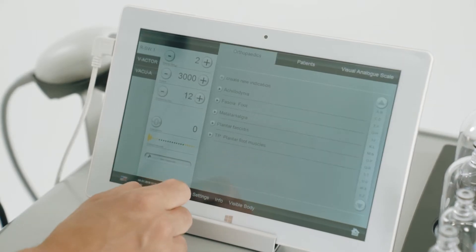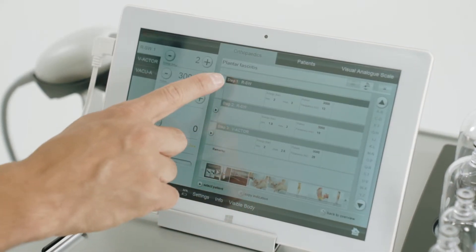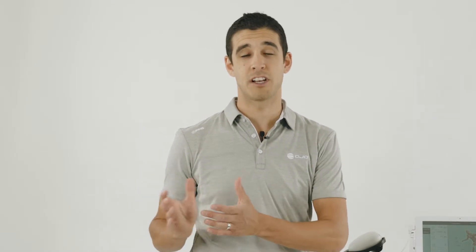The MP200 tablet comes inbuilt with all the clinical protocols. Simply select the body part you wish to treat and follow the prompts. You will notice that step one and step two use the radial handpiece, with the first step being for the tendon treatment and the second step being for the muscular treatment. The third step uses the V-actor.